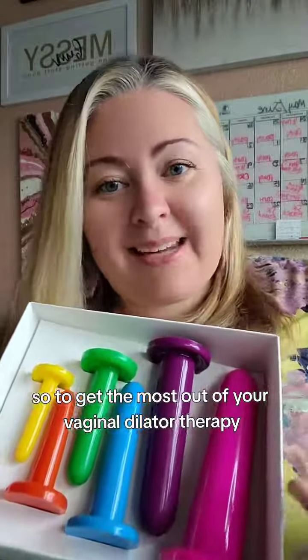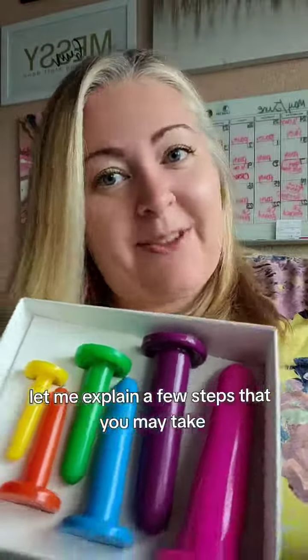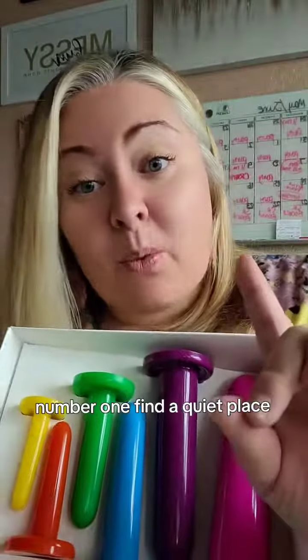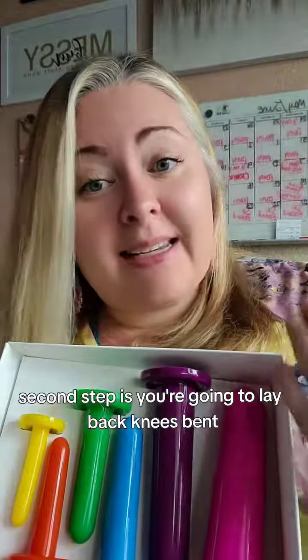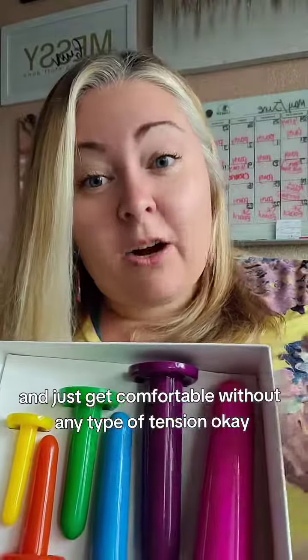So to get the most out of your vaginal dilator therapy, let me explain a few steps that you may take. Number one, find a quiet place. Sit down, relax, take a few deep breaths in, find yourself some inner peace. Second step is you're going to lay back, knees bent, possibly in a diamond shape, and just get comfortable without any type of tension.